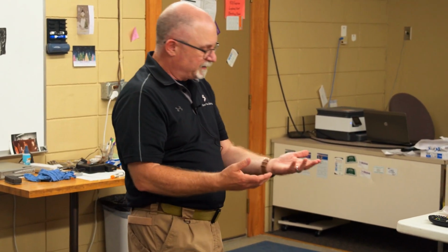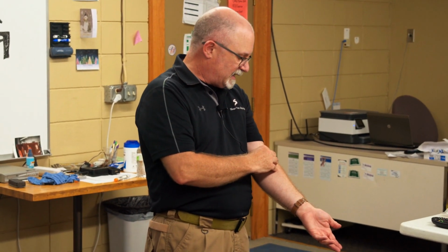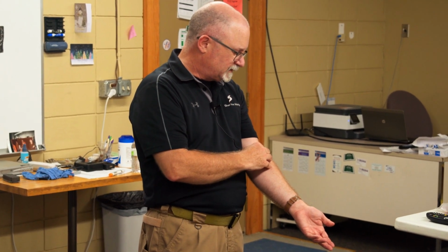If you do blow it and you start to flush, you have to check it periodically as we're going. If we have an infiltration, saline itself is not that big a deal because the body will absorb it and it'll be fine. D10 can be a bigger deal because it's a little bit more caustic and can cause some necrosis. D50 is super hypertonic. It screws things up badly, but you're not giving that. So the sooner you catch that, the better. If you do have infiltration with D10, you want to make sure you note it and that the hospital's aware of it because they may need to do some other treatments on that. All right, those are all the risks.